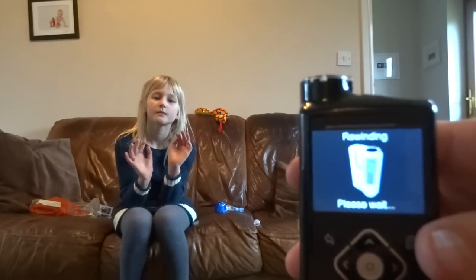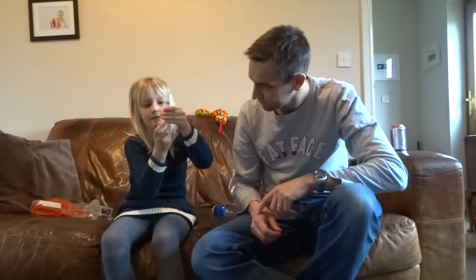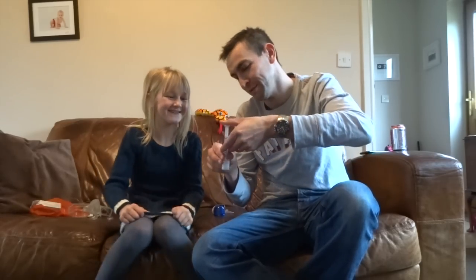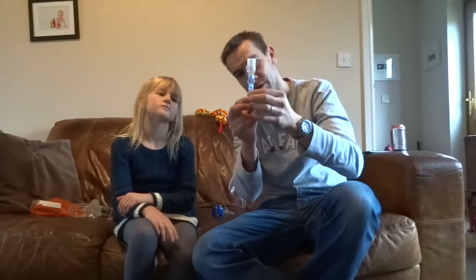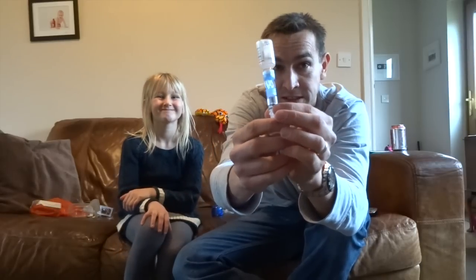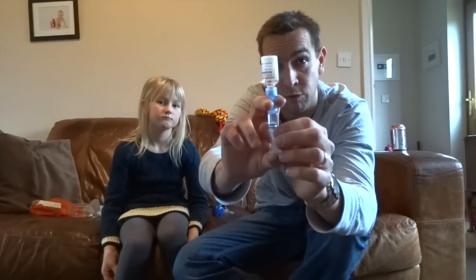While it's doing that, we'll fill up the reservoir with insulin. We've pulled it back and we plunk that on there. It's quite tricky to go on with little fingers. Let's push it down, then we turn it the right way up so that the insulin's at the bottom of the vial, and we pull it down slowly. As I said before, I use about 20 to 25 units a day, so I don't need to fill the reservoir all the way — it lasts me three days. I normally get to about 100 units when I'm filling, because that's all I need. I don't want to waste too much.